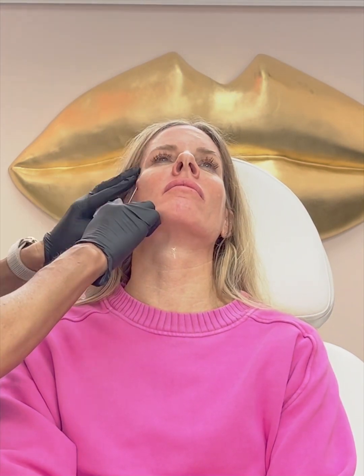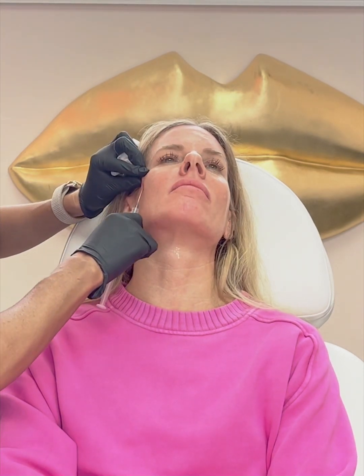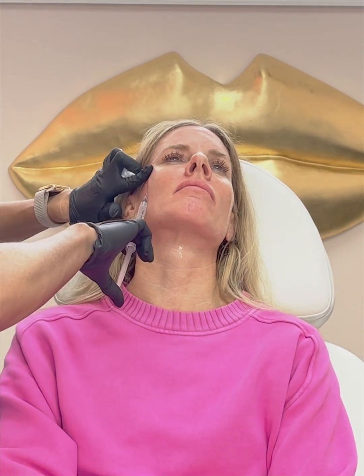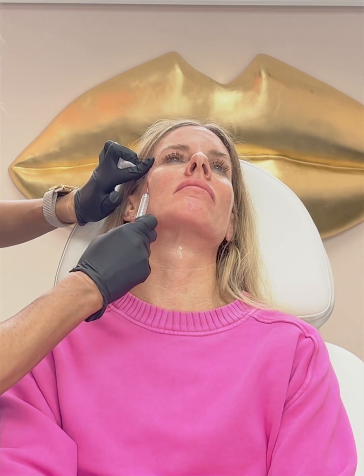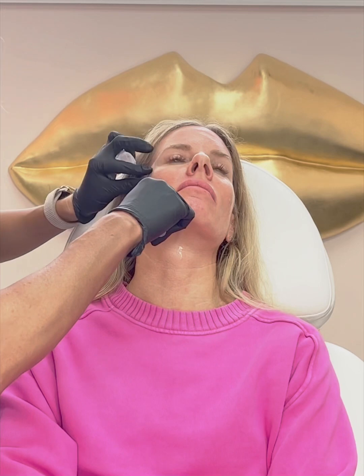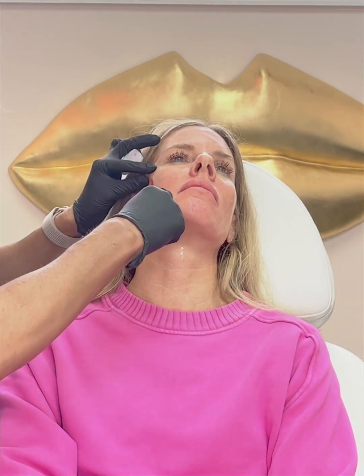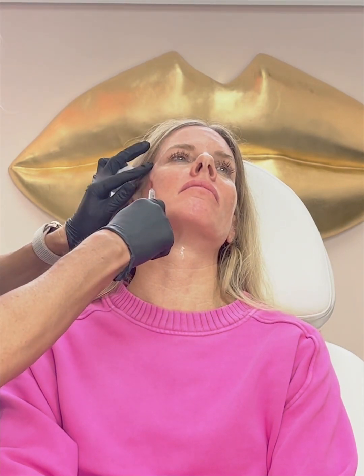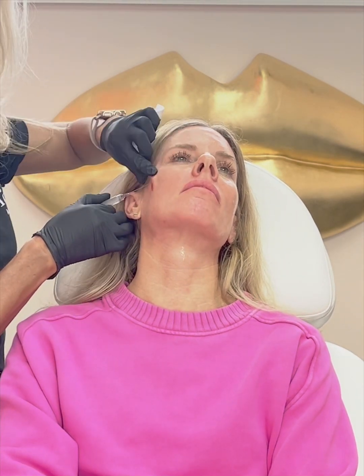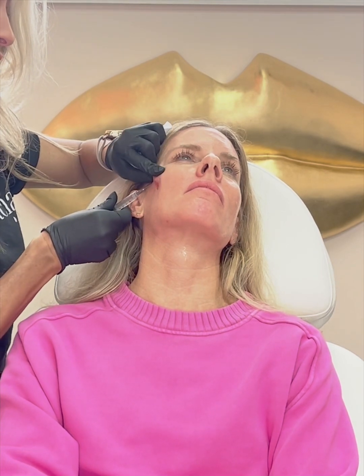So she's not going to have an instant result from this procedure. Now, right when we're done, she will look as if she has an instant result, being that she'll be a little bit filled out, she'll look a little lifted, but that is because this product is diluted with a good bit of sterile water. And so that's exactly what you're seeing, is just the fluid that's there. Over the course of the next 2 to 3 days, her body will reabsorb that, and then the particles of the Sculptra will be left behind. And that's what's going to start stimulating the collagen and elastin for her true and accurate results, which will start to be seen at around 6 to 8 weeks after the procedure.